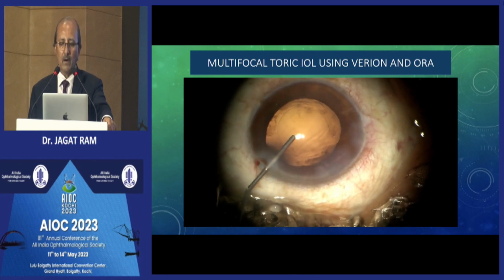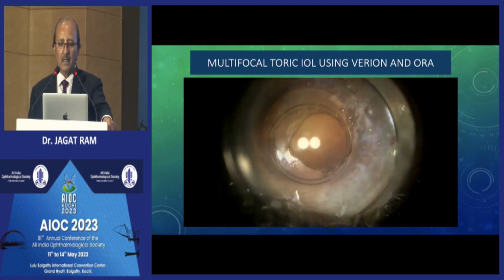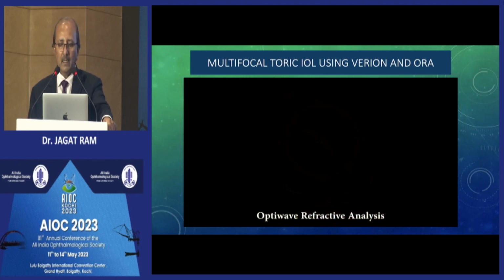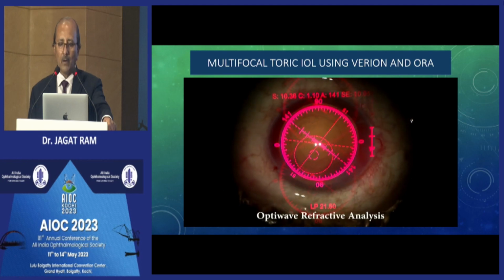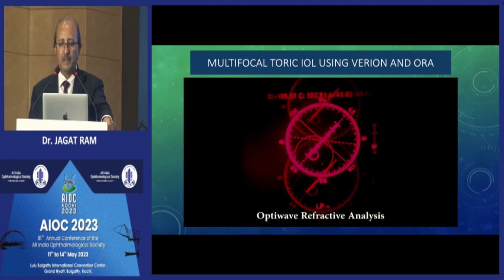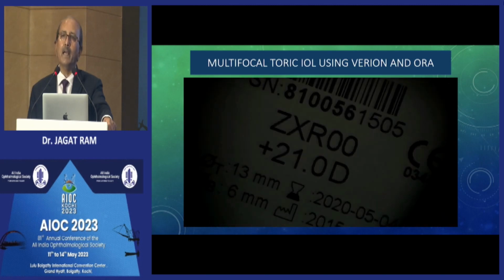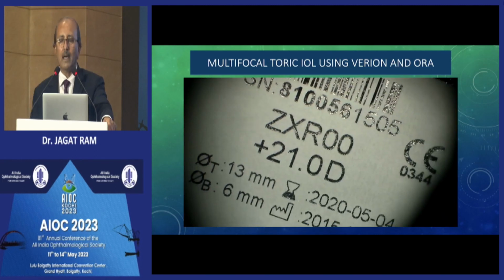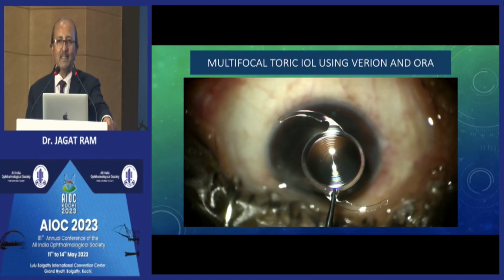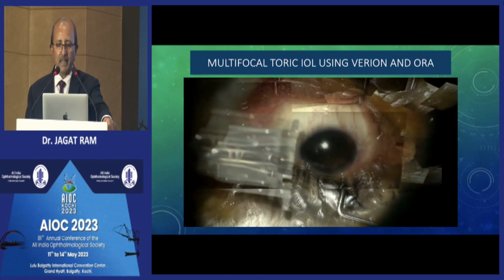Once we remove the cortex, we fill the anterior chamber and capsular bag with viscoelastic and do ORA. And this is the power. Already we have done the power with IOLMaster and other modalities, but we match whether it is the same or it differs, and it is very accurate.